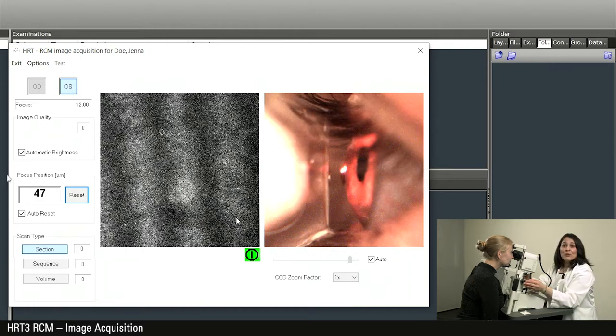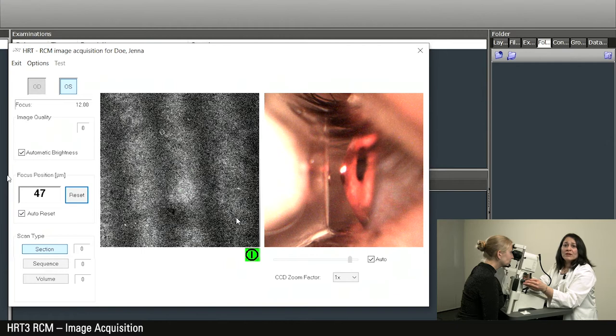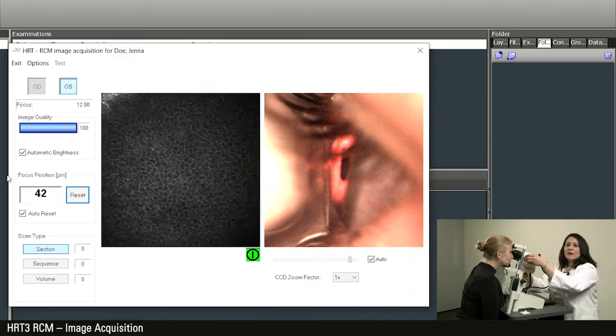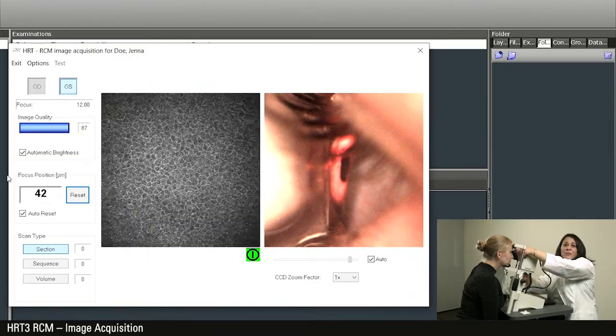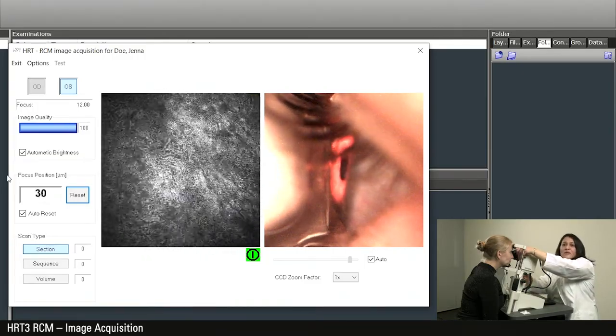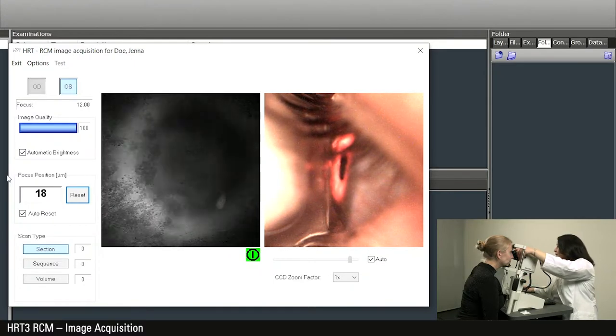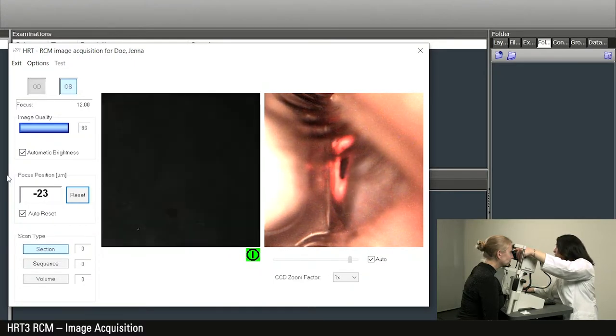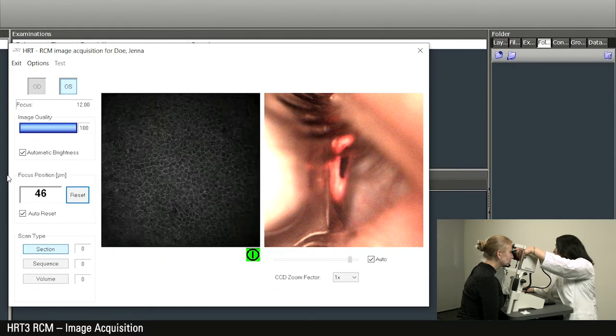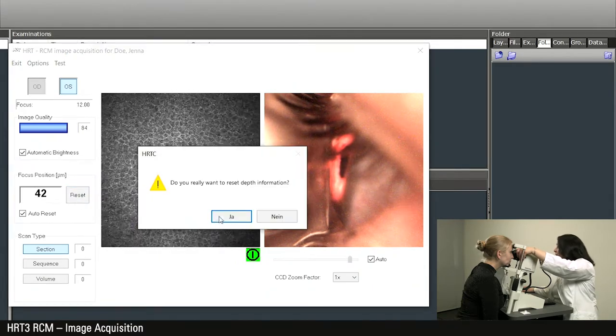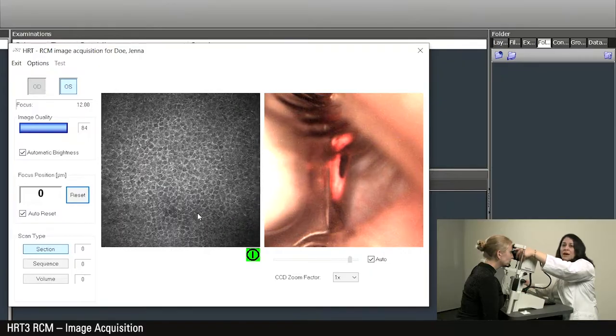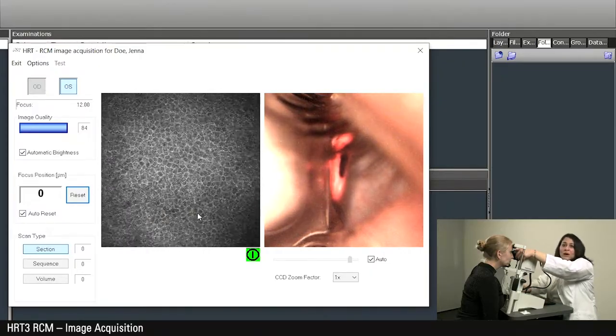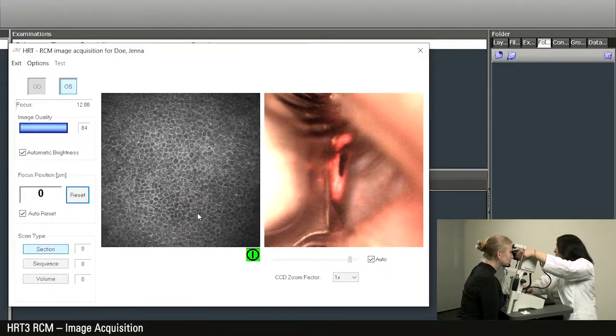Now move the camera towards the patient's eye until you see on the CCD camera image that you have contact with the cornea. Now you turn the RCM microscope lens counterclockwise until the superficial epithelium is visible.